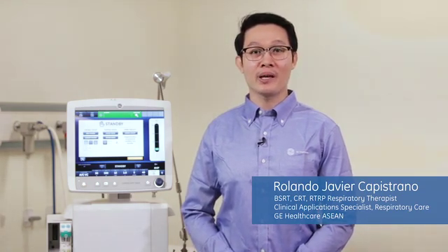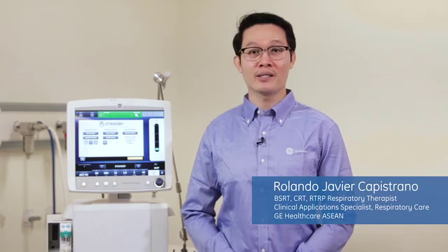Hi everyone, my name is Rolando Capistrano. I am a respiratory therapist and I am the clinical application specialist for respiratory care for GE Healthcare in ASEAN.